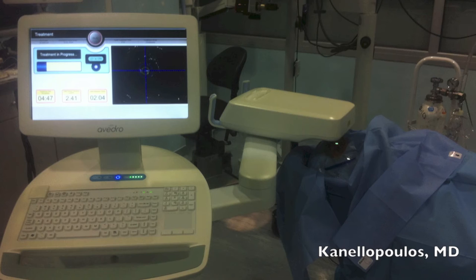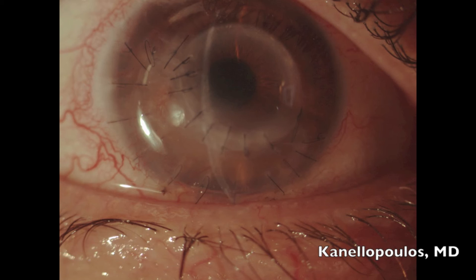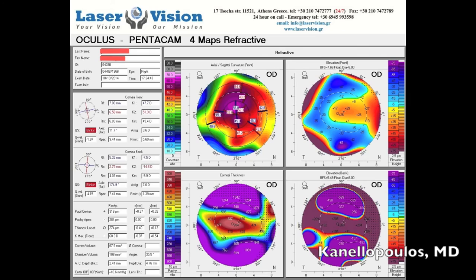This is the eye a week after. Vision, surprisingly, is 20/25. A month later the patient is still 20/25 uncorrected. We'll see a Scheimpflug-derived tomography in a few seconds. There's no sign of infection; the cornea is clear and quiet.